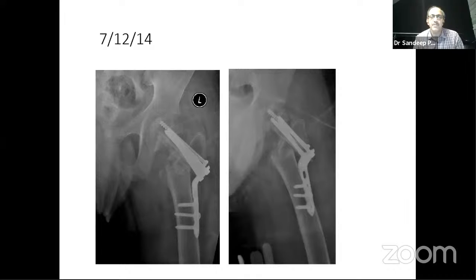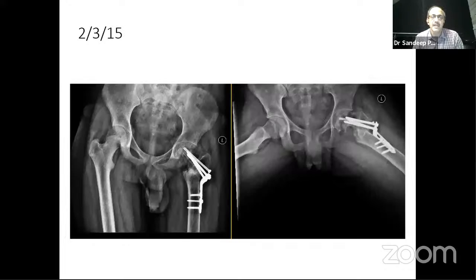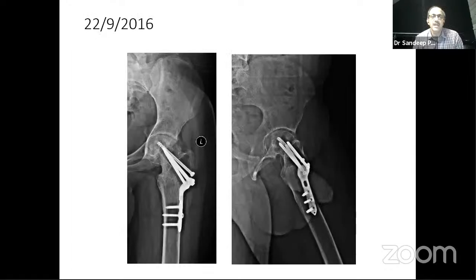We just changed the biomechanics. We drilled across the bone, put a fibula as a strut. This was a dead fibula, not a live vascular fibula. Over a period of time, you see that this went on to a satisfactory healing, and the cystic areas and the sclerotic areas in the head also gradually started revascularizing. And 2 years down the line, this child has a pretty functional hip. I think Venkat has also removed the implants. There was a little cam there, which he has removed, and the child continues to do well.